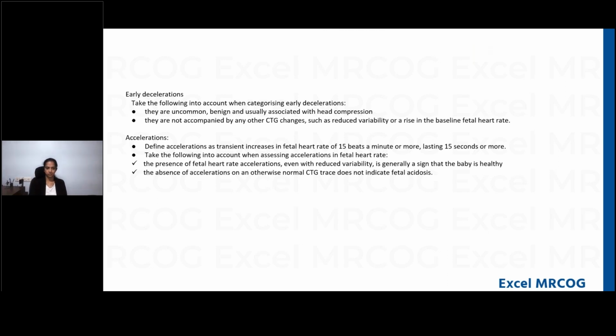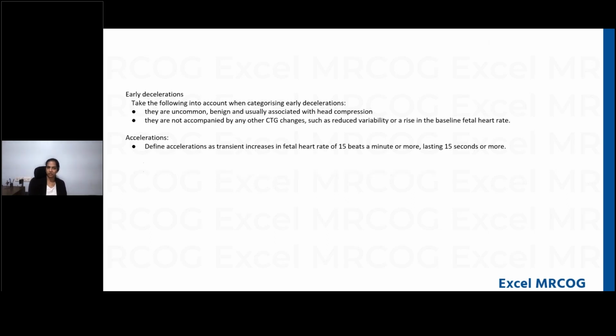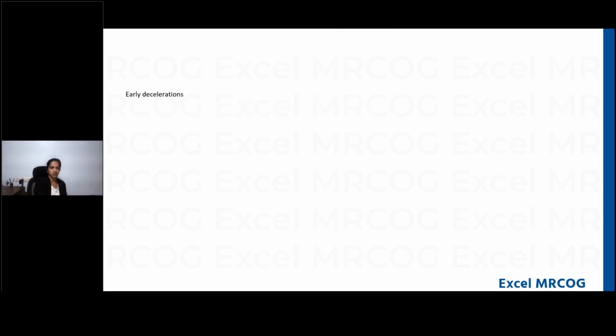Ma'am, like in a teaching station, when we are starting, initially we also have to say there are some prerequisites. We have to check the speed of the paper, the name and NHS number of the patient. All these things have to be said. Yes, you have to check the speed of the paper and confirm that it belongs to that particular patient.